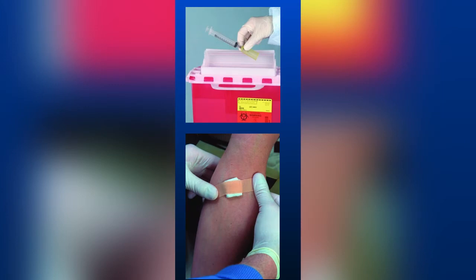Place gauze, remove needle, activate safety features, and apply pressure. Discard collection unit. Label tubes. Observe special handling instruction. Check patient's arm and apply bandage.